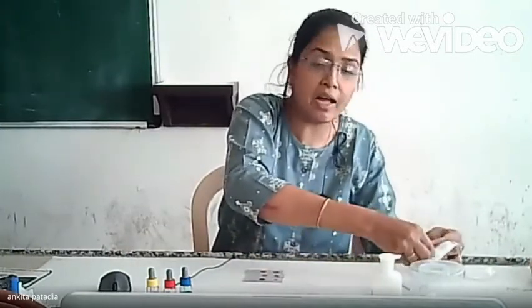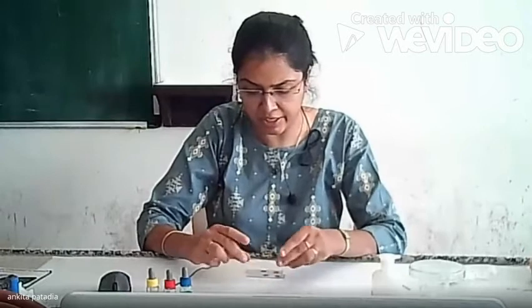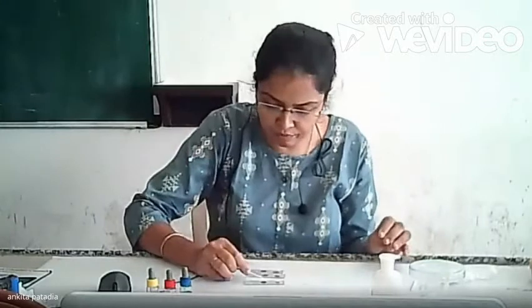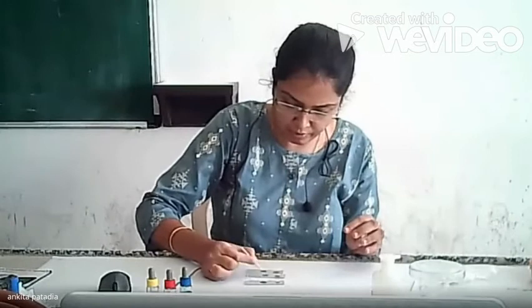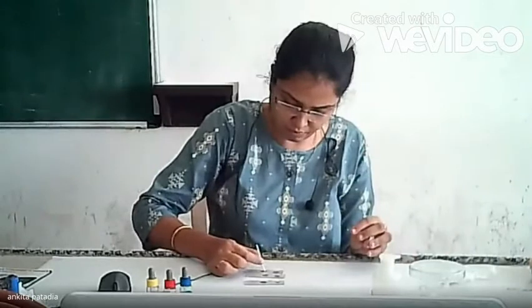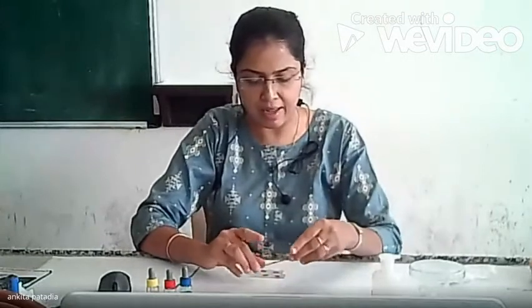You can rotate the slide with the drops to mix, or you can use this applicator stick for the mixing purpose, but at this time you have to use a different stick for each cavity. Now mix it well and rotate it.